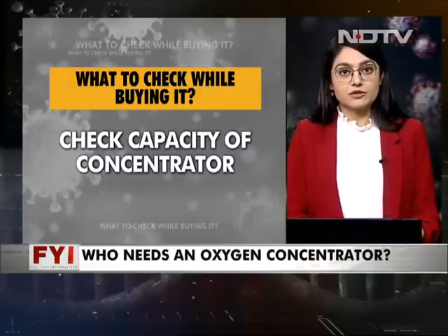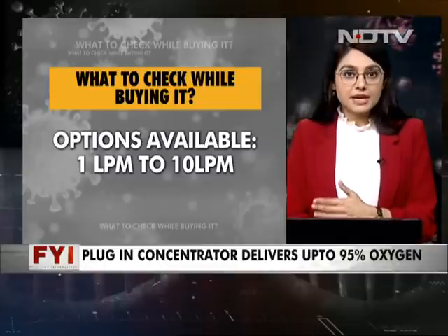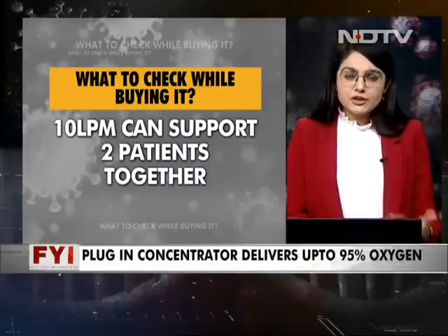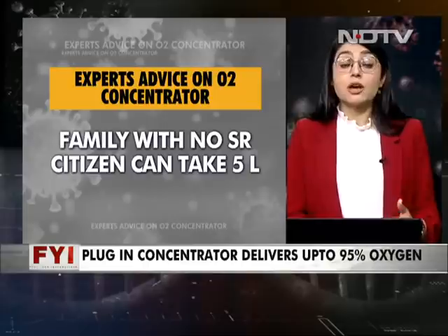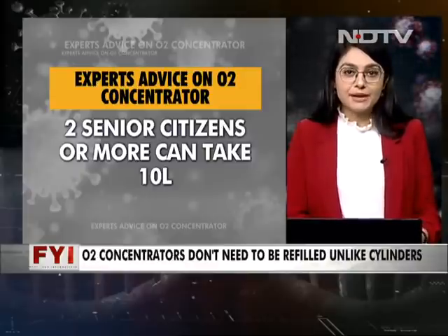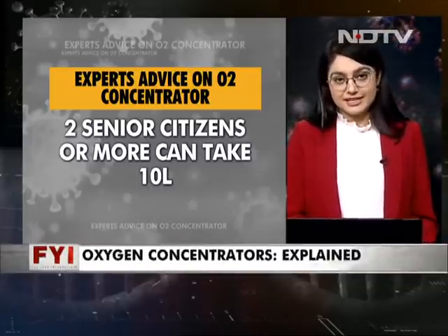The other thing that will be thrown at you once you go out to buy will be the capacity of the concentrator. Oxygen concentrators are available in 1 LPM, 3, 5, 8 and 10 as well, LPM meaning liters per minute. Which one you buy should strictly be on the advice of your doctor. But in general, the advice from the experts is that for a small family with no senior citizens, a 5 liter at 90% oxygen concentration is good enough. But if you have 2 or more senior citizens in the family and it's a big family, then a 10 liter with 90% oxygen concentration should be good, as it can also support about 2 patients at the same time if the need arises. So keep these things in mind and make an informed choice.